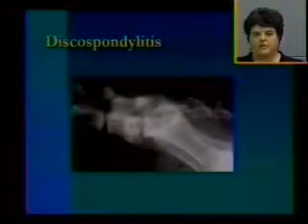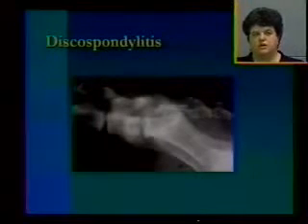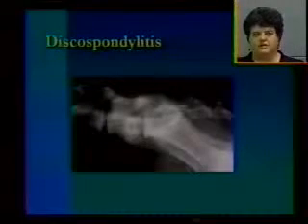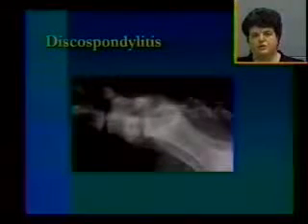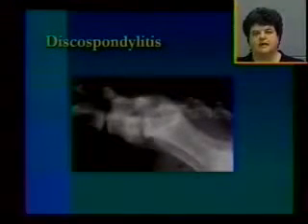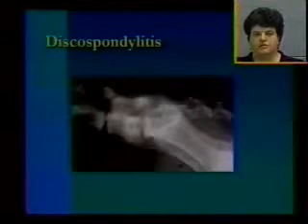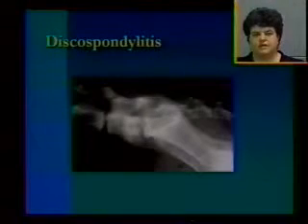There's also a sclerotic appearance to the bone surrounding those lucencies, suggesting that the bone within the vertebrae are trying to wall off the infection. And then you can see at the ventral caudal aspect of L7, there's also some irregularly marginated, sort of variably mineralized new bone formation. This is another good NAVLE question because discospondylitis, first you need to know that it's an infectious process. You need to recognize that it's probably not a tumor because it's affecting both sides of a joint in the spine. And then also need to know the agents that cause this.